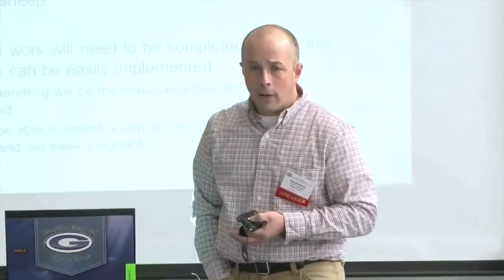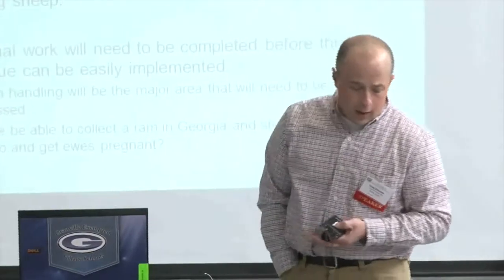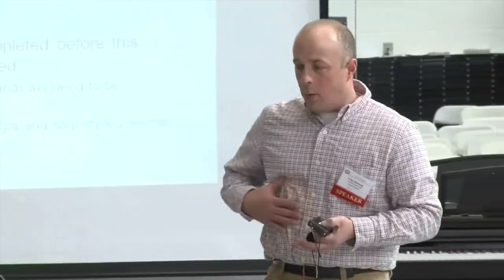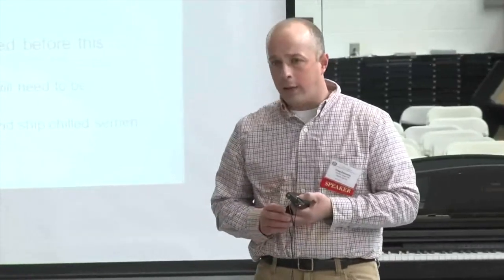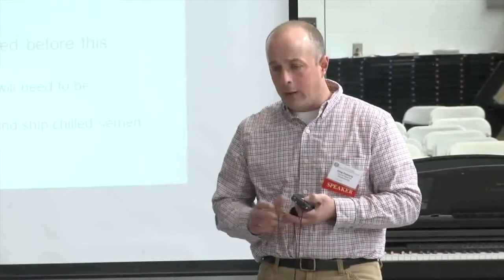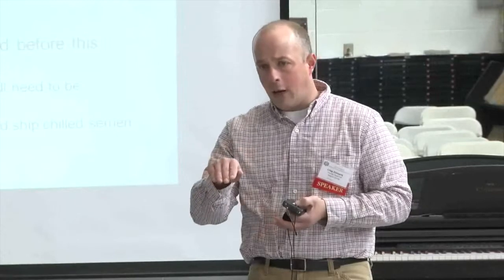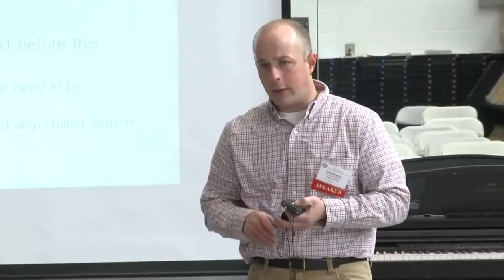I'm not familiar with the electroejaculator. What that is, there's a rod that fits into the rectum of the ram, and electric pulses are released, and that causes the ram to extend his penis and causes ejaculation.